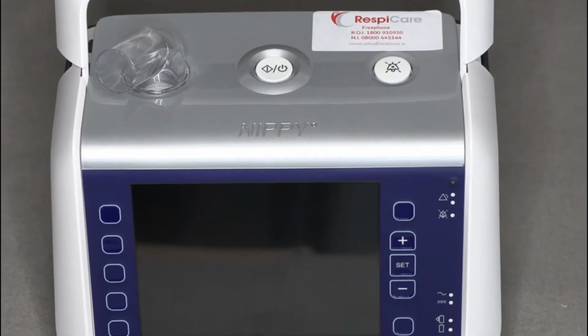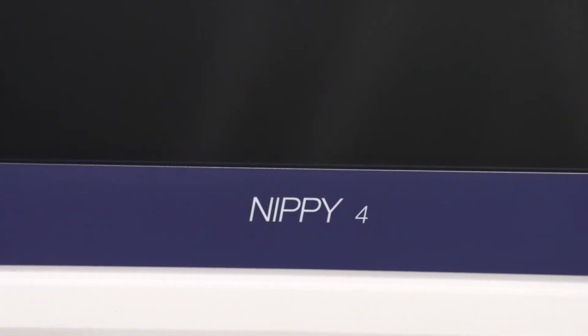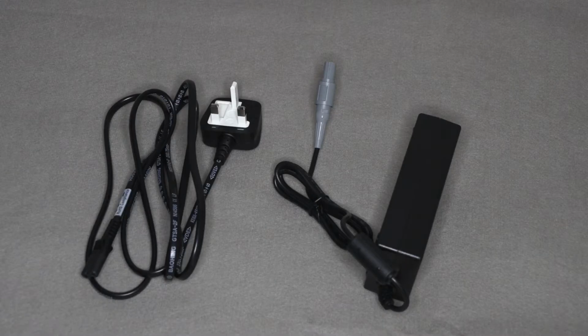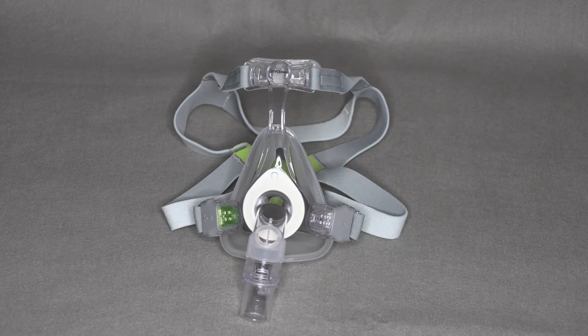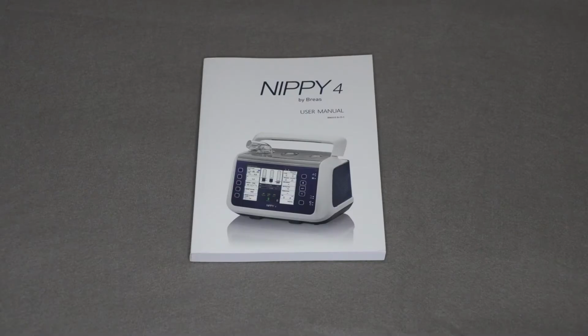Nippy 4 should be used as recommended by the staff at the hospital where the ventilator was prescribed. To use Nippy 4, you should have the Nippy 4 device itself, a power supply and mains cable, a standard reusable breathing tube, an appropriate mask, an oxygen connection if oxygen is required, some spare filters, and a user manual.